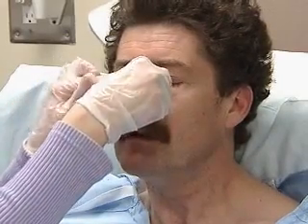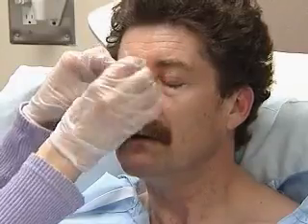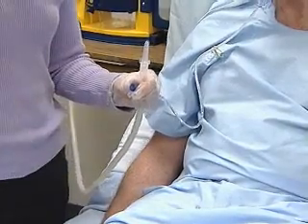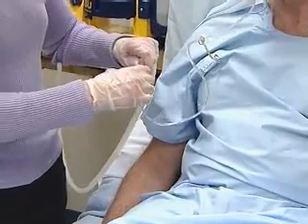Once you've verified the tube's placement, secure it with tape to the patient's nose. Clamp the end or connect it to a drainage bag or suction machine and fasten the end to the patient's gown.